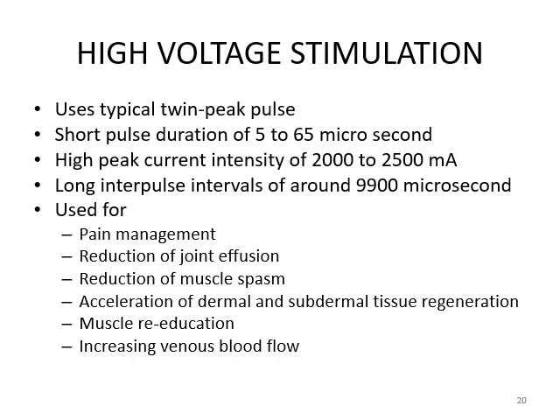The primary indications of the high voltage stimulations are pain management, reduction of joint effusion, reduction of muscle spasm, to enhance the dermal and subdermal tissue regeneration. It may be used for muscle reeducation, and it may improve the venous blood circulation.